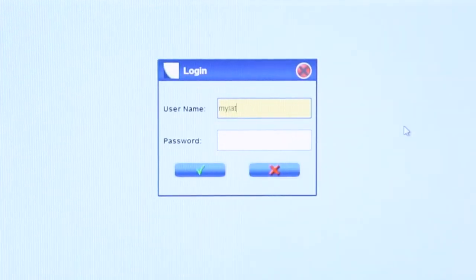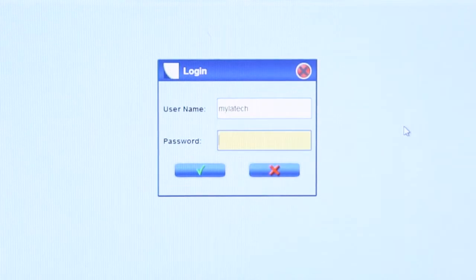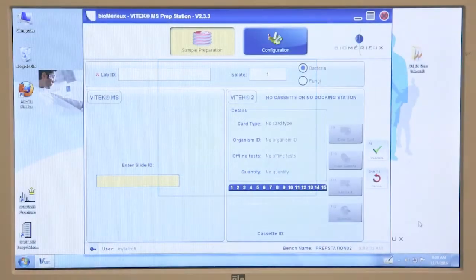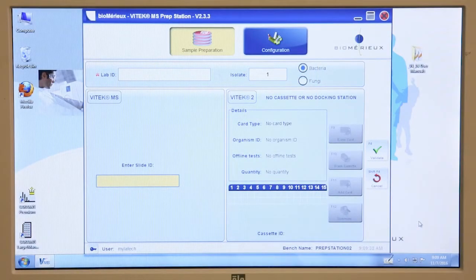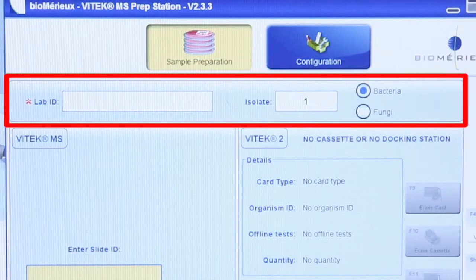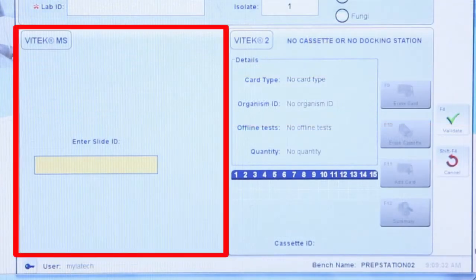Log in to the PrepStation software by entering a MyLa username and password with Vitec MS tech privileges. The sample preparation screen displays by default. General specimen information is entered at the top of the screen, and Vitec MS target slide information is entered on the left side of the screen.